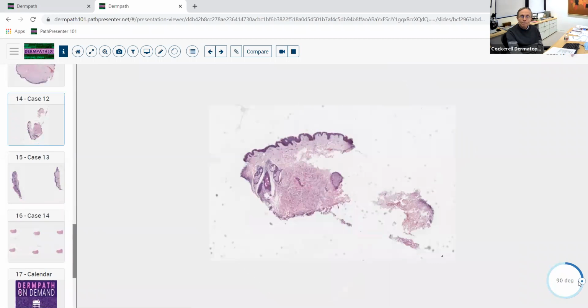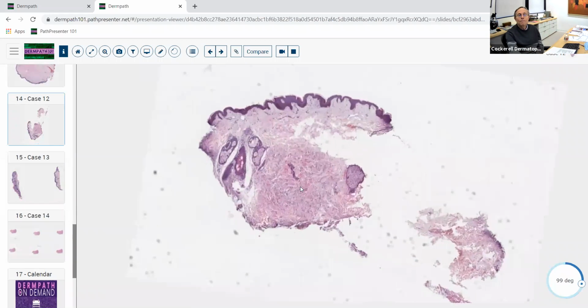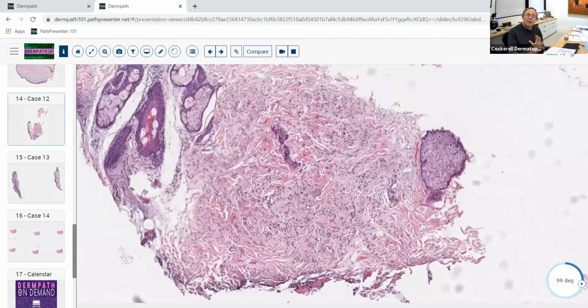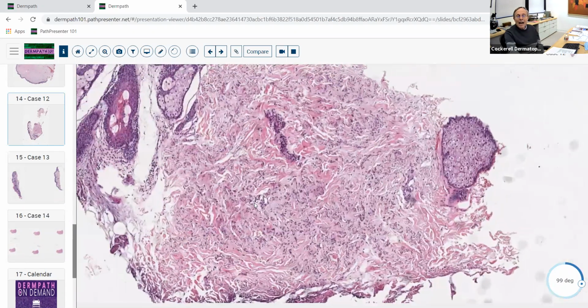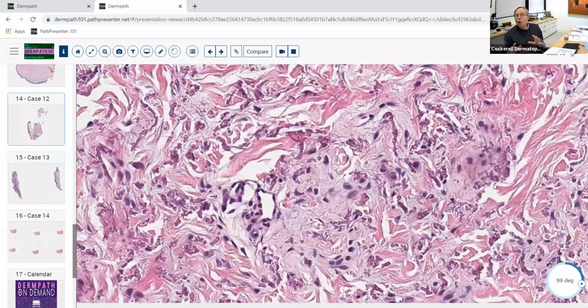Now this, another disease. A punch biopsy, and almost nothing that we see from an inflammatory perspective here. As we go to higher magnification, we've got this bizarre appearance in the dermis here. And if we go to highest magnification, we see what looks like steel wool.